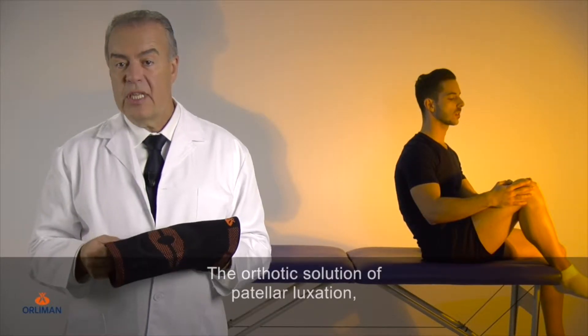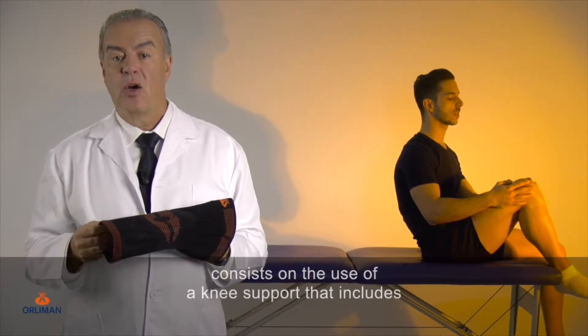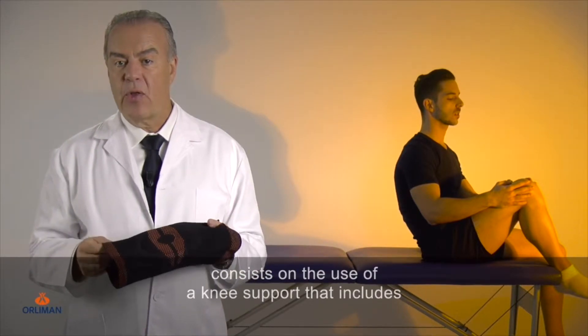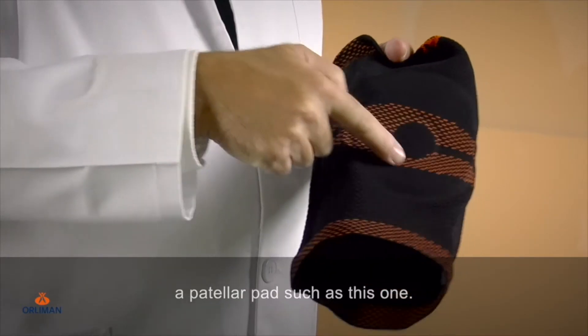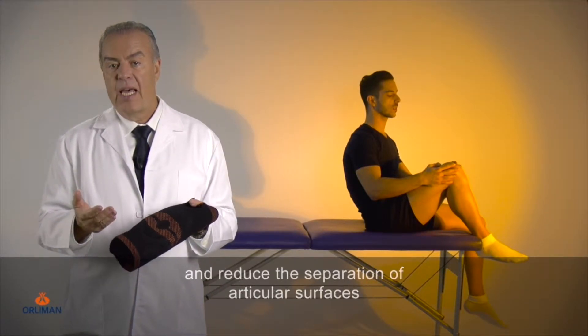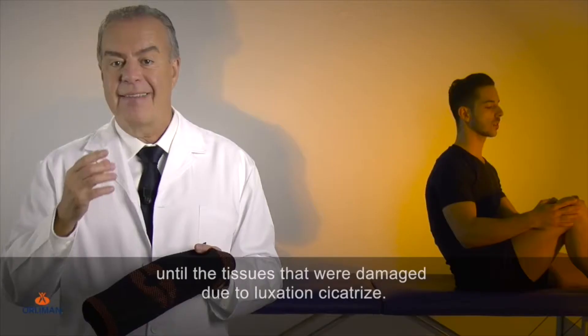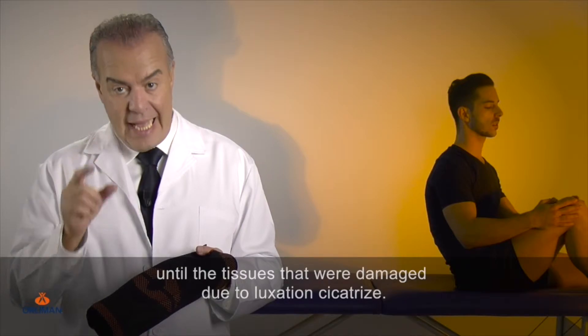The orthotic solution for patella luxation, even for sports practice, consists of the use of a knee support that includes a patella pad such as this one. In this way, we will be able to stabilize the patella and reduce the separation of articular surfaces until the tissues that were damaged due to luxation cicatrize.